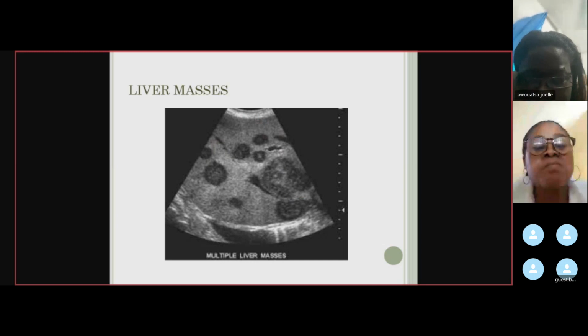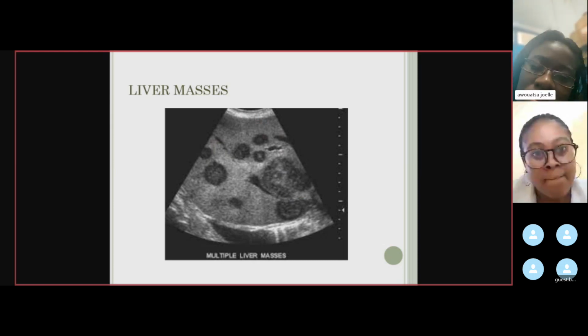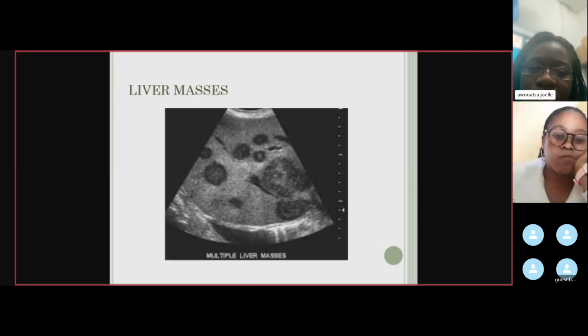Coming to bio effects of ultrasound, that is biosafety. Why is ultrasound said to be safe, but still there are some studies going on about whether it is actually safe for pregnant ladies and the fetus? Since the fetus is continuously growing, the cells are continuously multiplying, so the ultrasound will have some effects. In the first class I told you that when ultrasound leaves the transducer, it undergoes four processes. I'll finish this part.